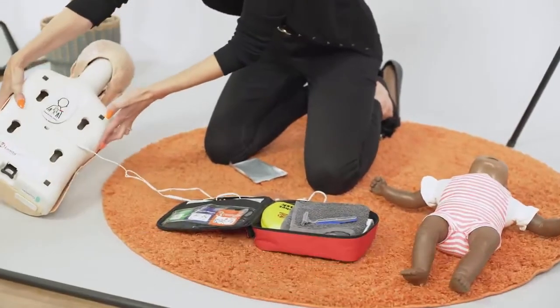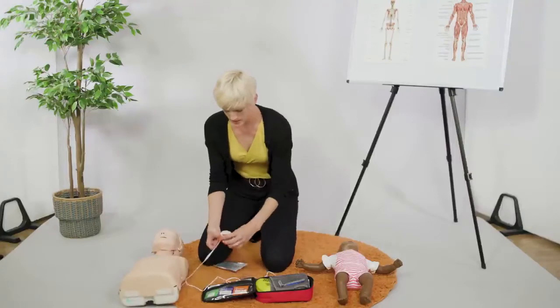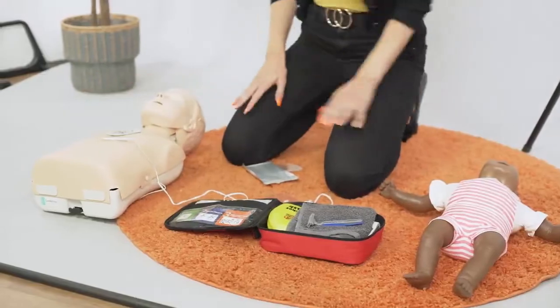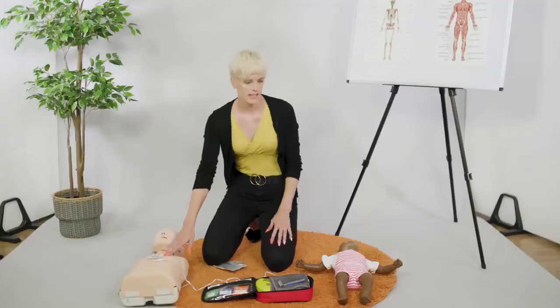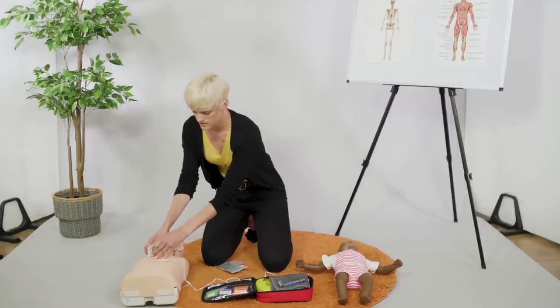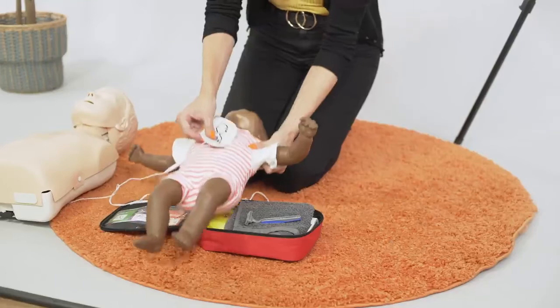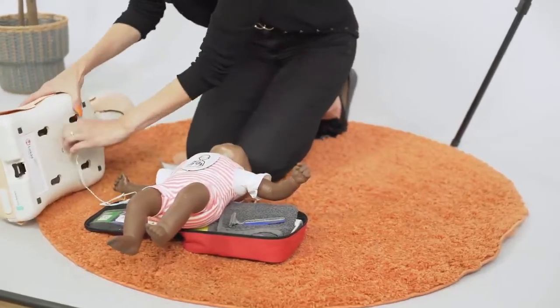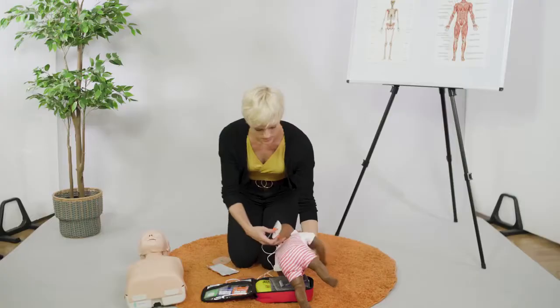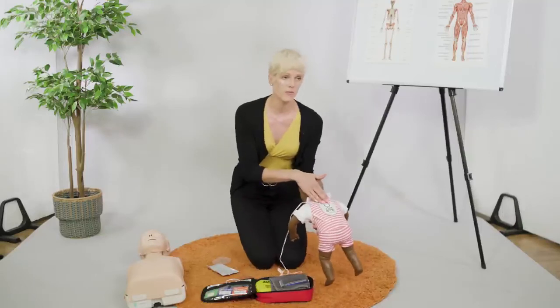One pad goes in the center of the back, in between the shoulder blades. We're basically going to sandwich them — so one in the center on the chest as well. That'll be exactly the same on the baby: one on the front and one on the back, with no clothes on.